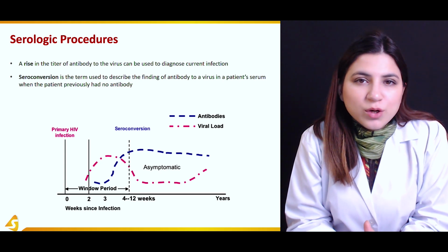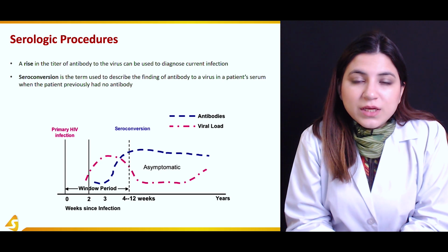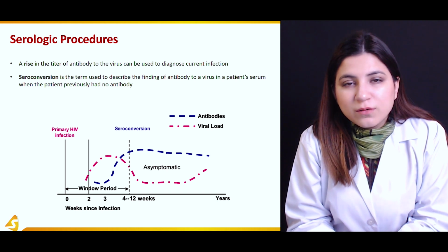So those antibodies can be detected and can help us quantify and stage the current and ongoing infection.